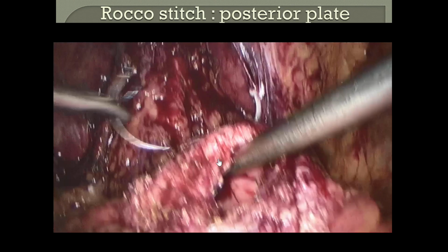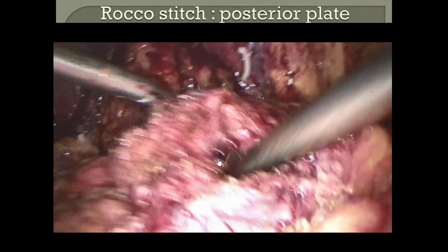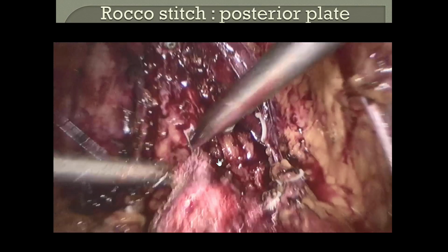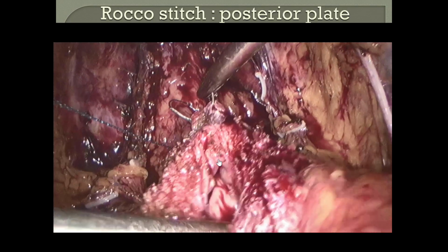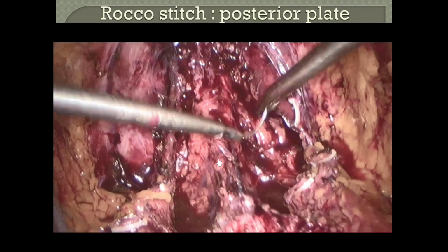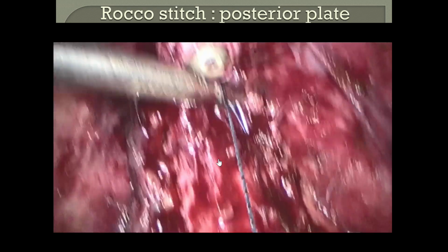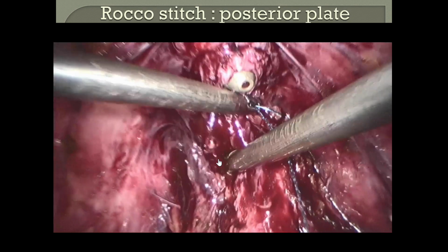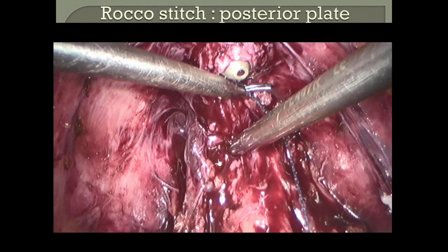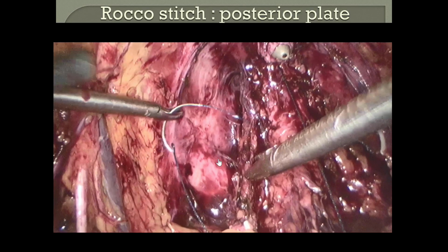Sometimes you have a case like this guy. It was 120 grams of prostate. The distance between the urethra and the bladder, you see, was very far. And here you should do Rocco stitches to reduce the tension. If you start immediately to do the anastomosis, you will have problems. So you see here, I will start by a Rocco stitch.